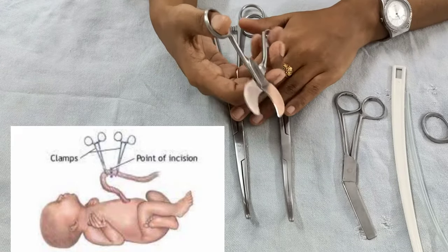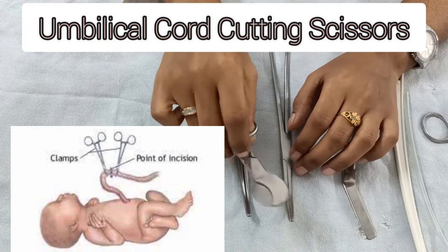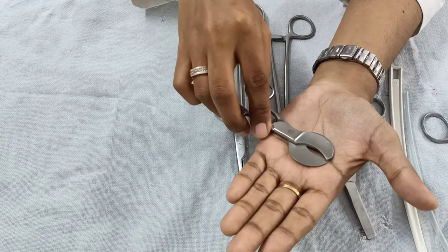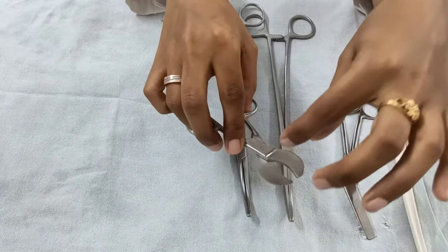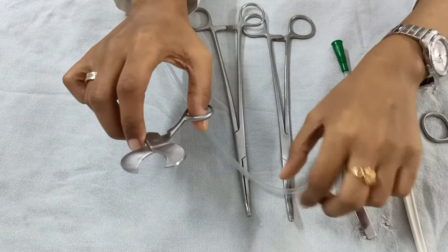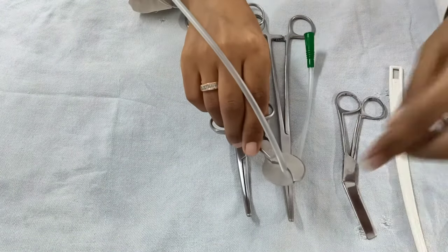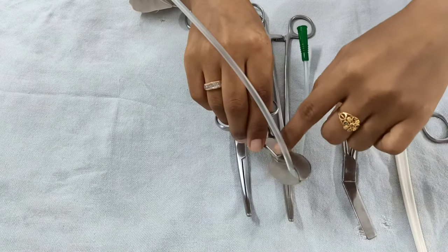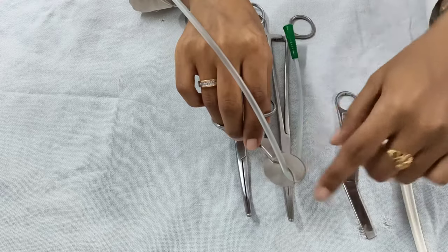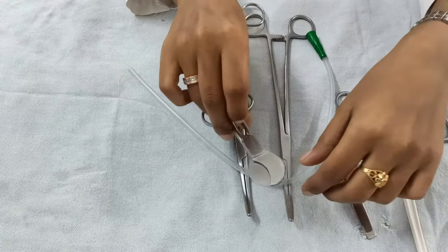After clamping the cord, you cut the umbilical cord between the two clamps. For cutting you require an umbilical cord scissor. You can imagine the cord clamped between the two cord clamps — the scissor gets a very nice grip of the cord between its two blades so the cord will not slip off.